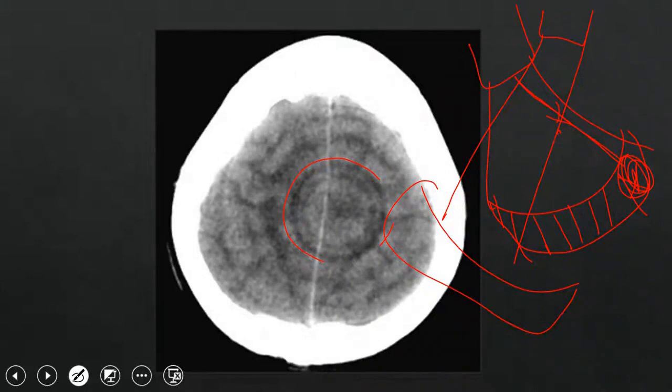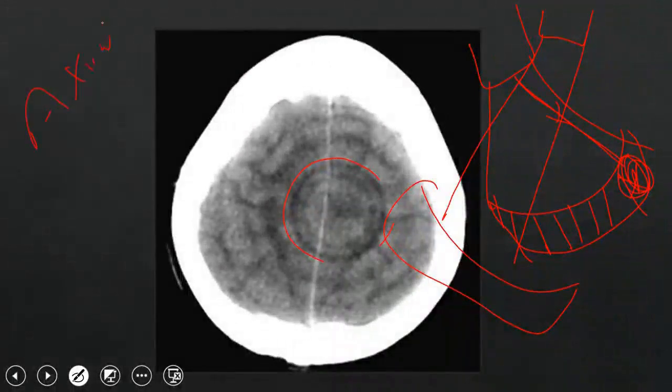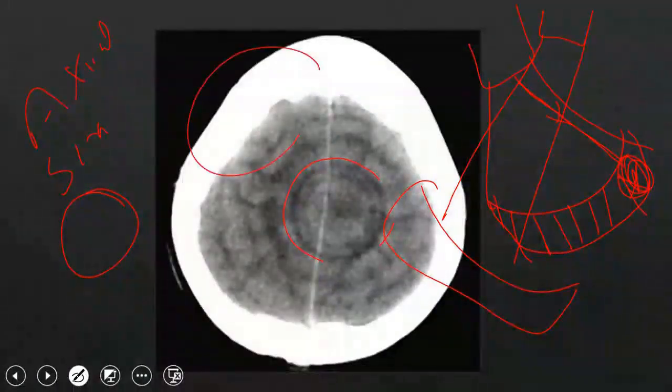This ring indicates that there is a malfunction, and that is why the ring appears this way. The ring can appear complete, or in parts of the scan, or in the scan where you are taking images around and the table is stationary. That's why a complete ring may appear, or it may not be a complete ring. It may appear like this, not a full circle.